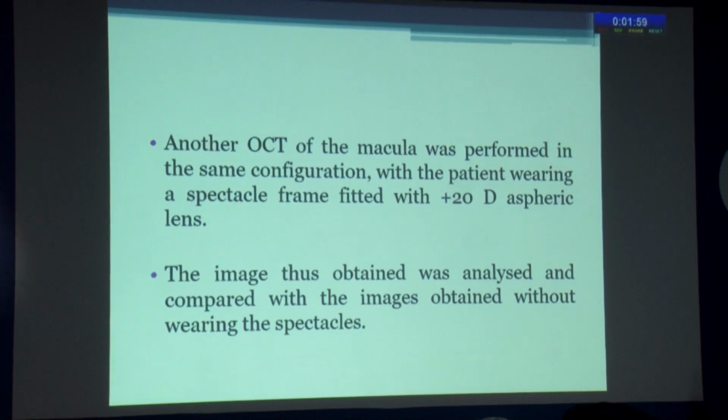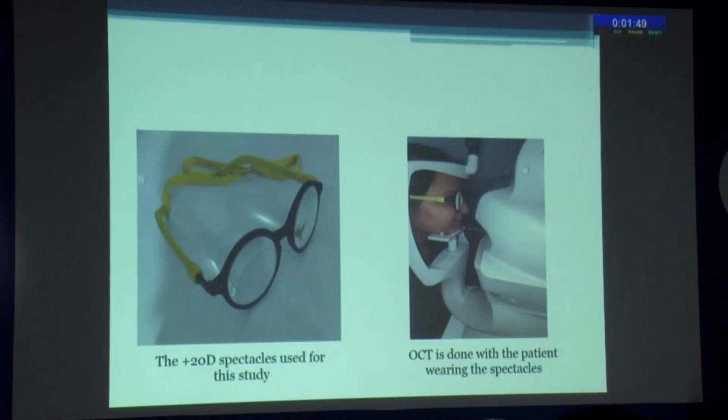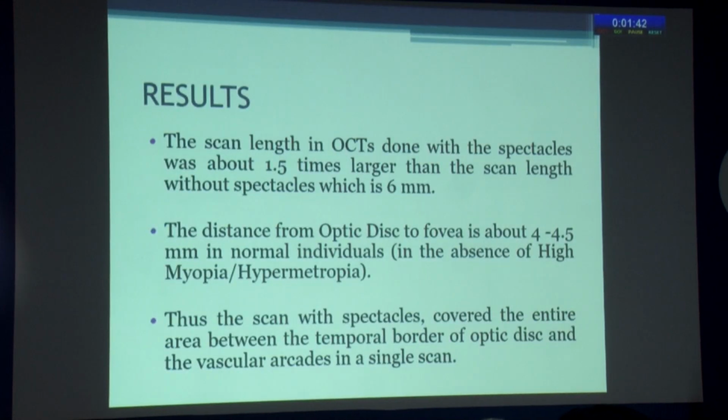I made the patient wear them, and the glasses had a back string attached so that they are firmly placed in front of the eyes. And the OCT was taken with the patient wearing these glasses. This is how the patient sits in front of the OCT wearing the glasses, and these are the glasses which I used. Now, the scan length of the OCTs done with the glasses increased by approximately 1.5 times the scan length without the glasses.